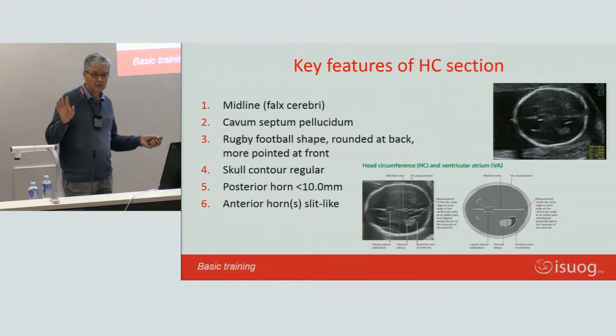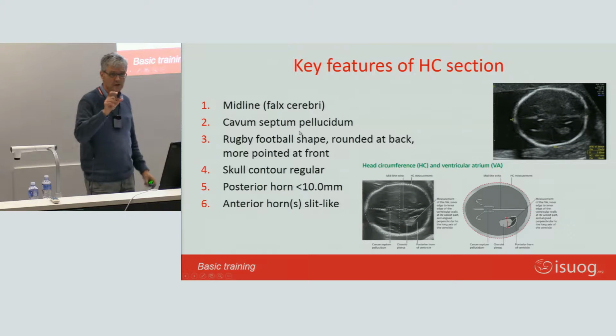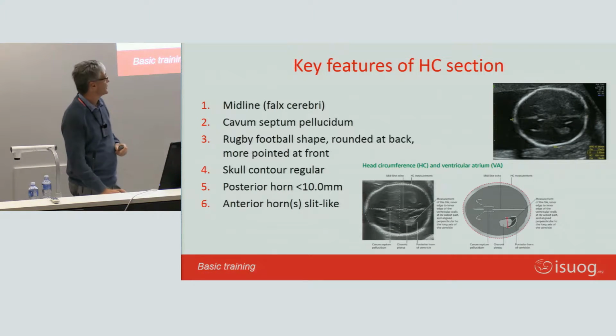Right, so you've heard what the head circumference measurement should look like. I think all this is really true. Midline, cavum septum pellucidum, and if you heard, it must be a completely black rectangle, nothing inside of it, otherwise you're not at a cavum.